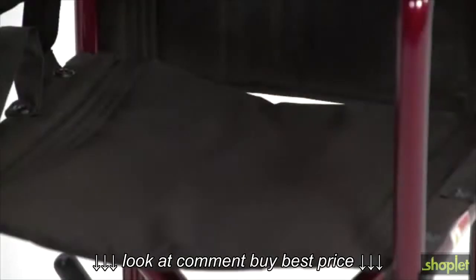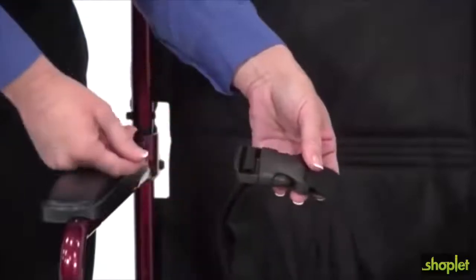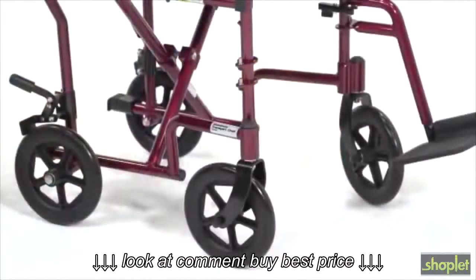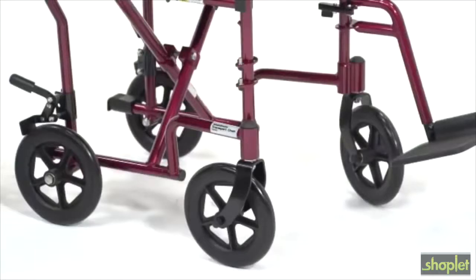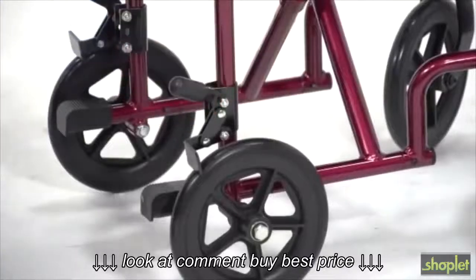The transport chair has a nylon seat that is breathable and easy to clean, and this built-in seat belt enhances passenger safety, as do the solid 8-inch wheels that also make for a smooth, stable ride over most surfaces. When at rest, these rear wheel locks secure the chair.